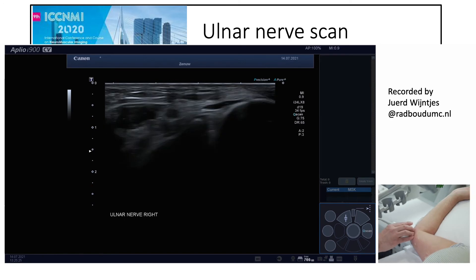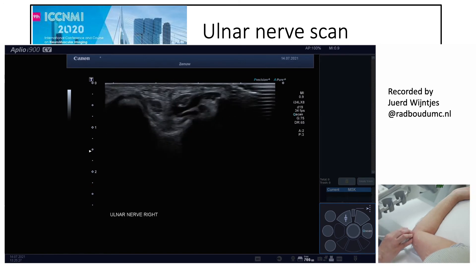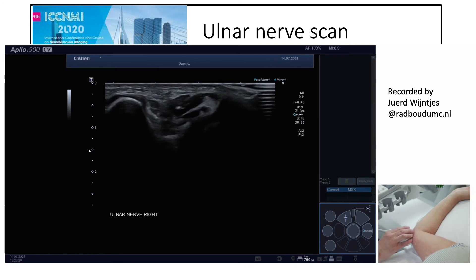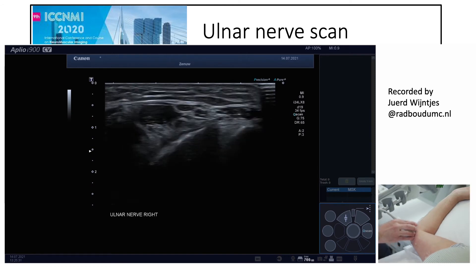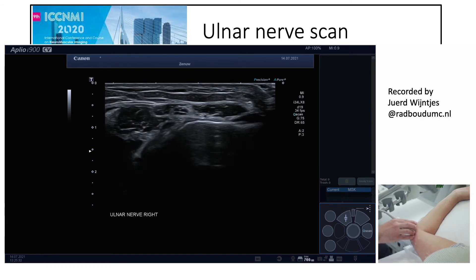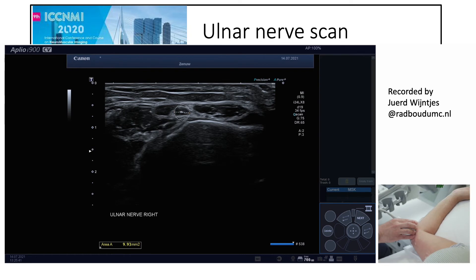We move distally around the medial epicondyle — here again is the triceps muscle, these are the two heads of the flexor carpi ulnaris, and this is the proximal part of the cubital tunnel. We take the measurement here as well.